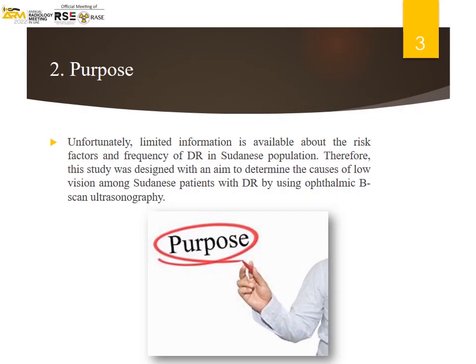In terms of the study's purpose, unfortunately little is known regarding the risk factors and prevalence of diabetic retinopathy in the Sudanese community. As a result, the purpose of this study was to use ocular B-scan ultrasonography to determine the causes of impaired vision in Sudanese patients with diabetic retinopathy.